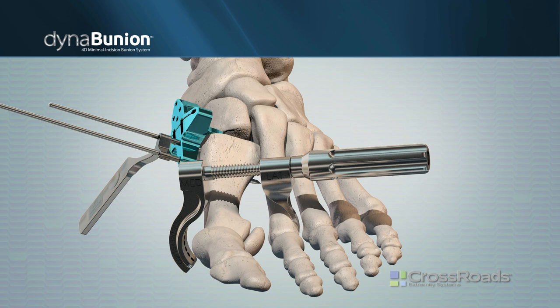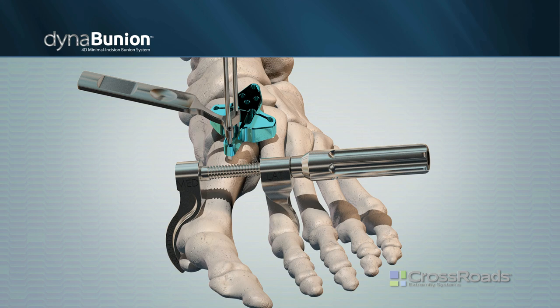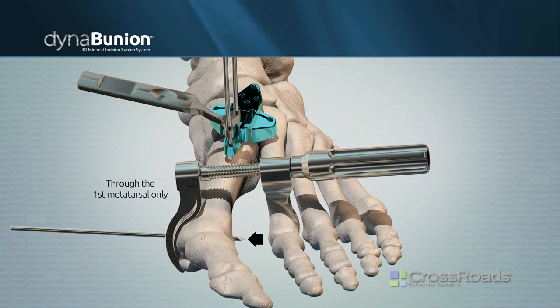With one hand, utilize the joystick to generate frontal plane correction by rotating the sesamoids into proper placement directly under the head of the metatarsal. With a second hand, place a 2 mm short wire through one of the holes in the medial hook into the metatarsal to lock frontal plane correction and hold the reducer in place. This wire should be placed bicortical, but should not penetrate the second metatarsal.